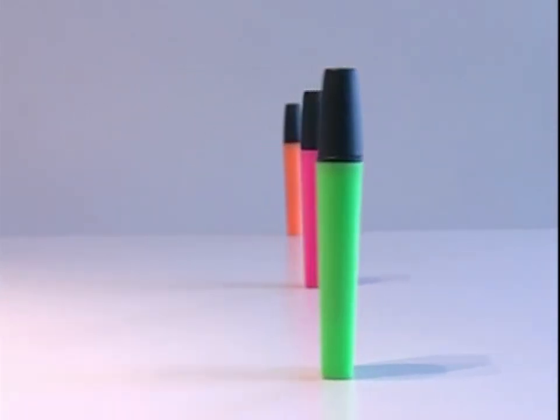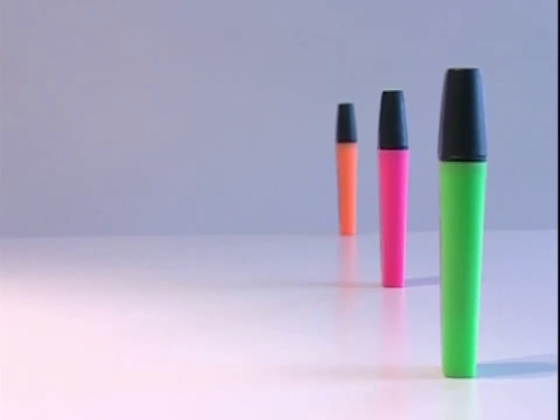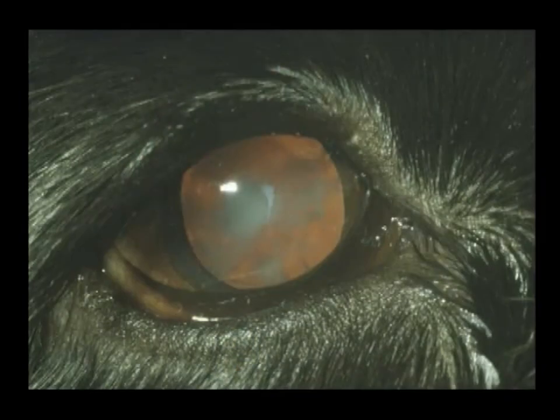This technique can be used to help differentiate nuclear sclerosis from cataract, as the nuclear sclerosis will still have a clear tapetal light reflection despite the obviously grey appearing lens on focal illumination, whilst cataracts will block some of the tapetal light reflection, resulting in a grey or black opacity.